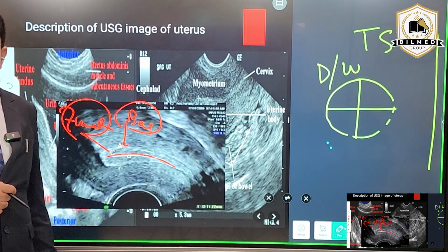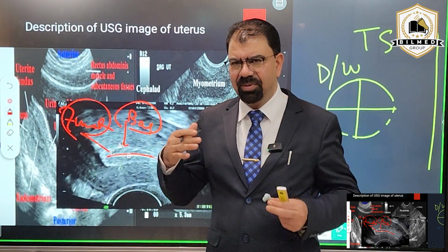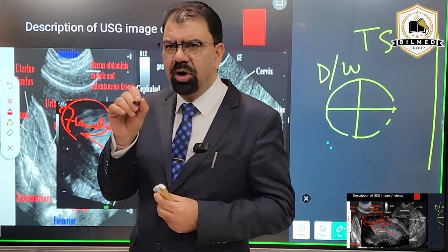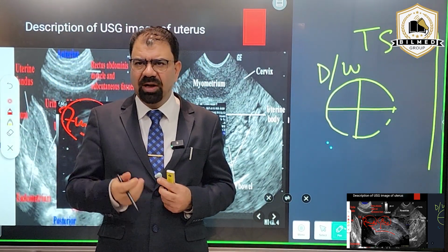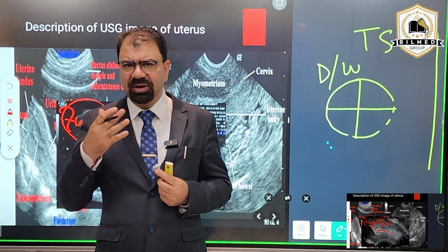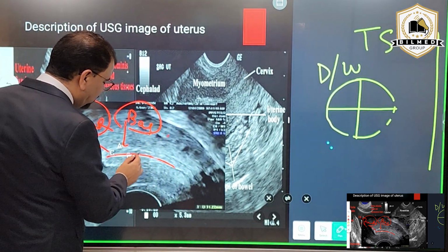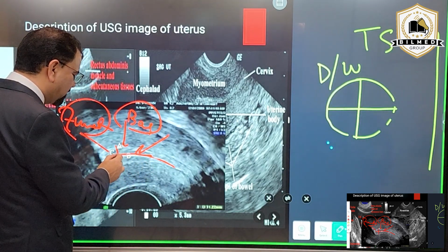So in this follicular study, you don't have to only concentrate on the follicle. I'm coming onto the folliculometry now. In folliculometry, you have to keep an equal eye on the endometrium also. Because if your follicle is growing, then it is rupturing. Ultimately, it has to go into the uterine cavity, because that is where it has to implant.